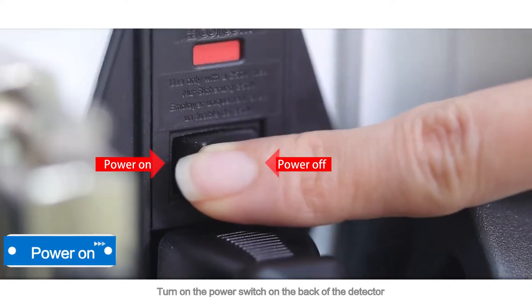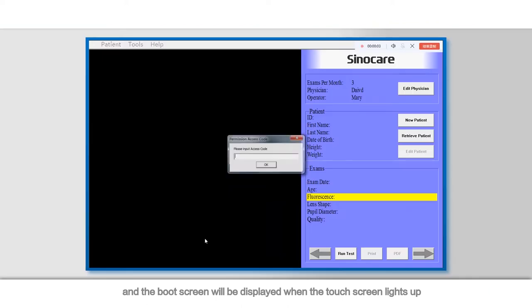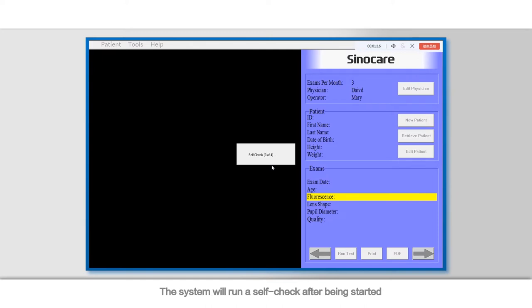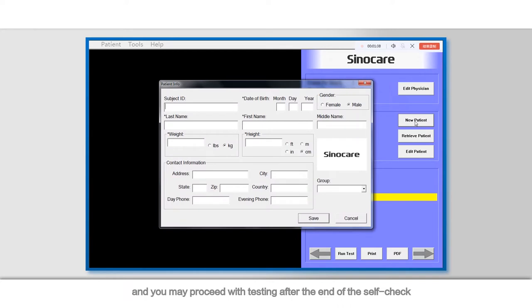Power on. Turn on the power switch on the back of the detector and the boot screen will be displayed when the touch screen lights up. Enter the user login password: SinoCare. The system will run a self-check after being started and you may proceed with testing after the end of the self-check.